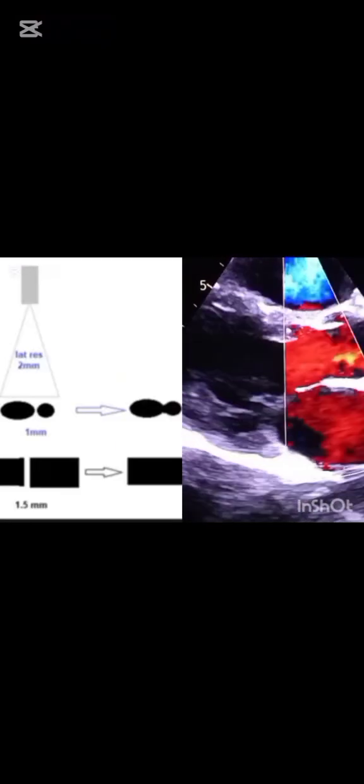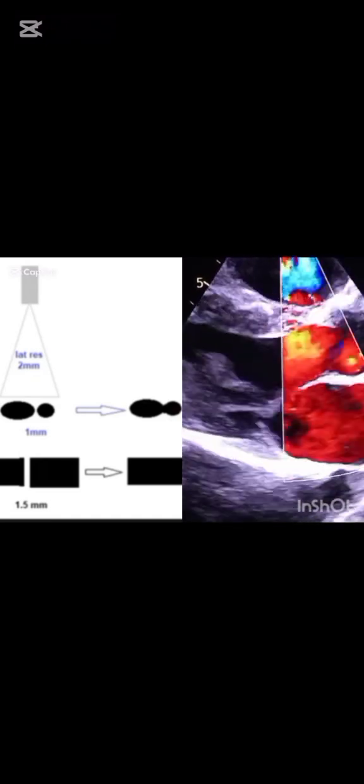There is no separation in this shape, it is one entity, but in reality there are two separate structures with a 1 mm distance between them. Now we have two structures. Take a septum here, and we are scanning with lateral resolution this way.